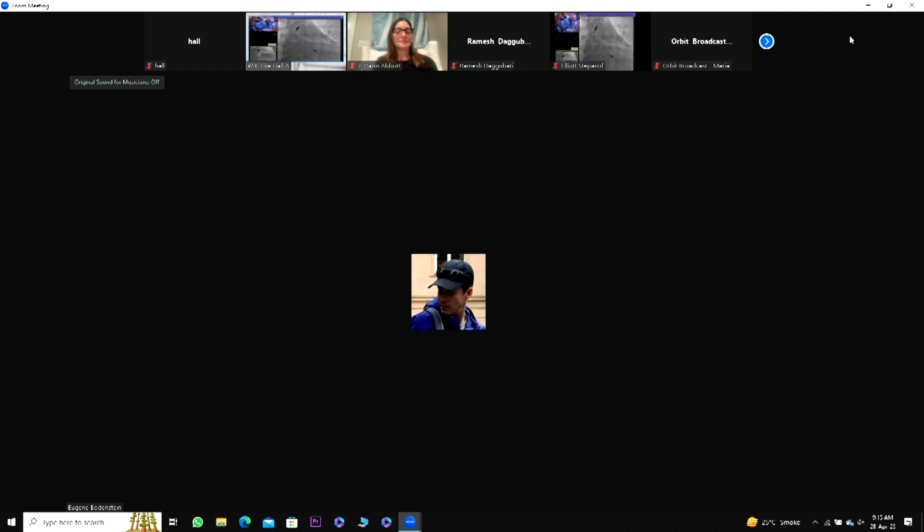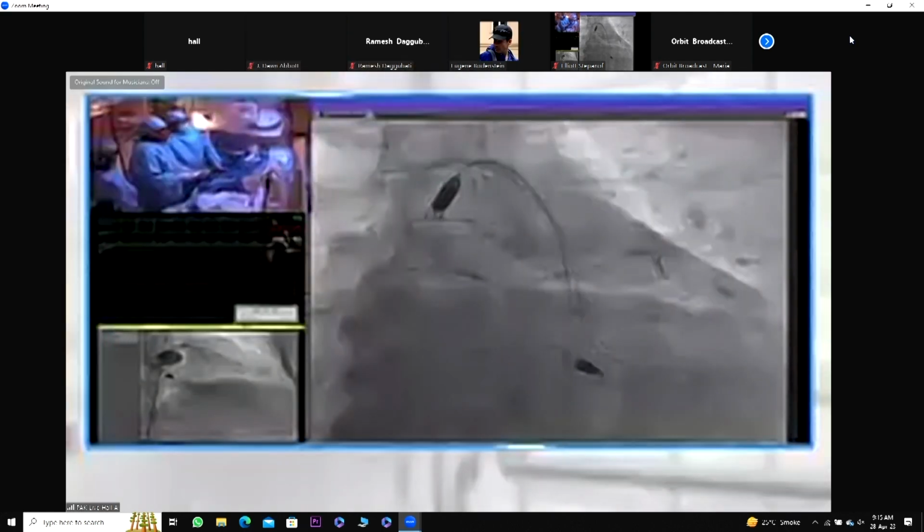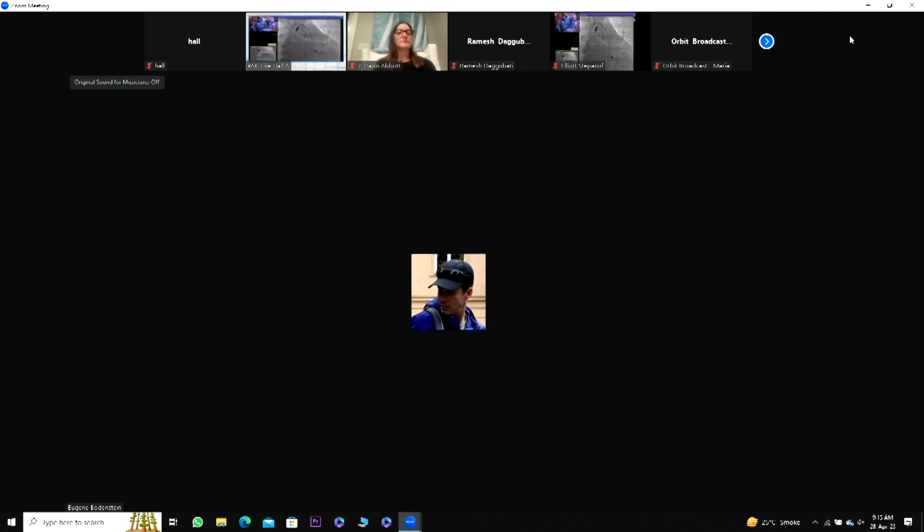And once we've done the final pot, we'll take some pictures, and then we're still going to do IVUS, but because I can't transmit the IVUS, I'll let everybody go at that point. Maybe a little more. Go back a little bit below. There you go. This is a 5.0 NC? Yes, this is a 5.0.